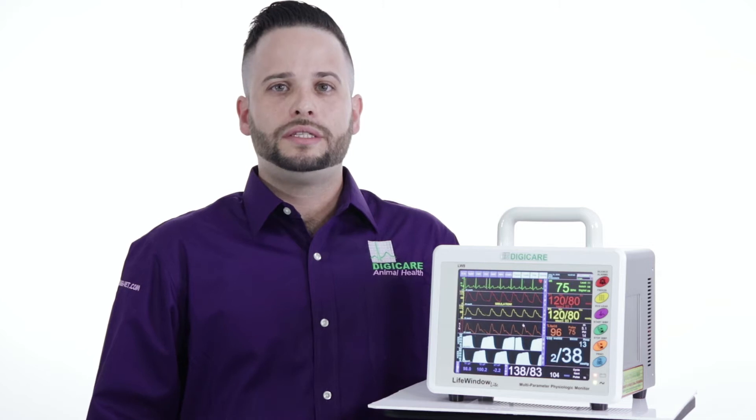You might ask yourself, how does this benefit? This means that with our monitor, you will get SpO2 that reads through motion and is designed to work on low-perfuse patients. An IBP that is motion tolerant, working on both patients that are under anesthesia and awake. Plus, ECG that works on all patients, even exotics with high heart rates.